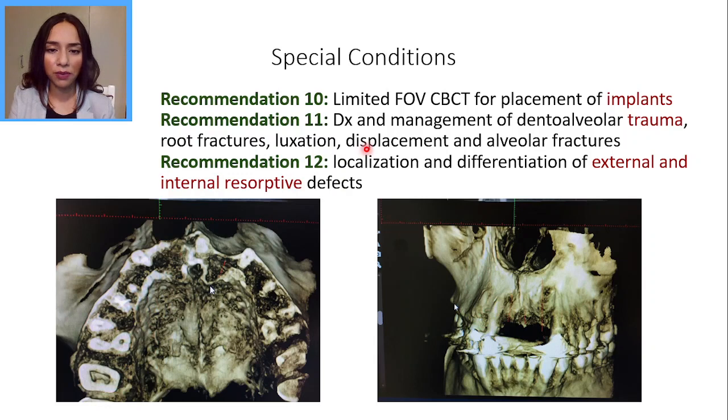In the 11th recommendation, we see how CBCT can be used for diagnosis and management of dental-alveolar trauma, root fractures, luxation, displacement, and alveolar fractures. And this is super important for all age groups, whether that be pediatric patients, who oftentimes experience certain types of trauma, falling, root fractures, dental alveolar fractures.